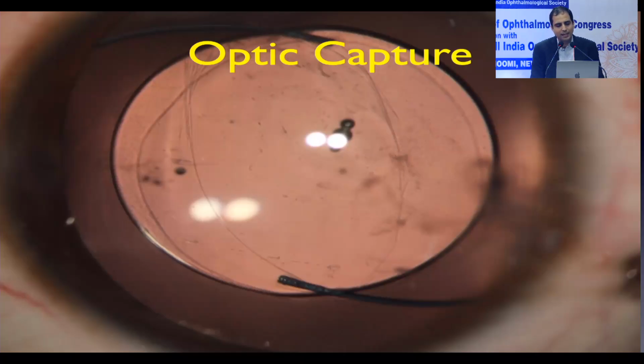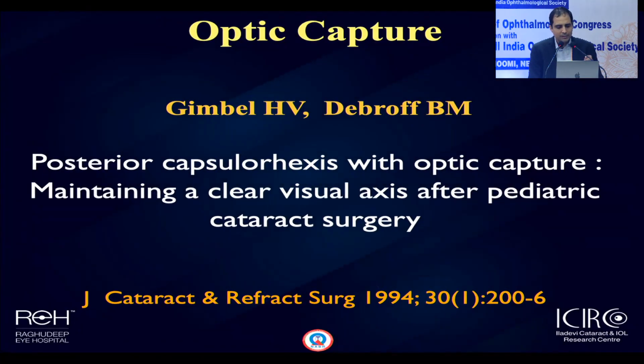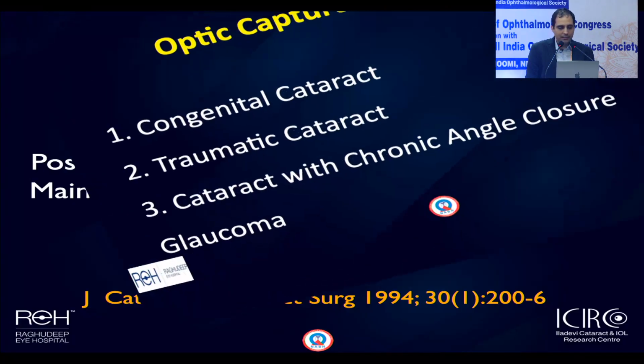Now coming to optic capture, something that is very close to our heart. Optic capture was described way back in 1994 by Dr. Howard Gimbel, and he showed significant, beautiful outcomes of clear visual axis after optic capture. In fact, we published an article a few years later showing how it is not useful and it causes a lot of inflammation and a lot of visual axis obscuration. But that's probably because of our lack of understanding of the surgical technique as well as the materials of the IOLs that we were using at that point of time.